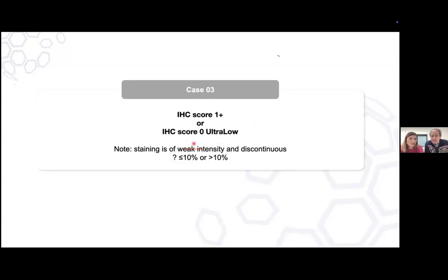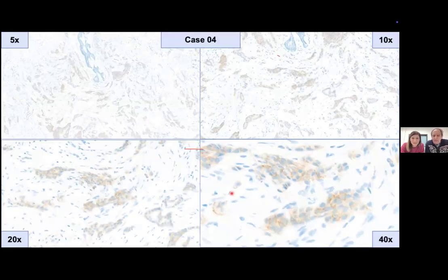Yes, fantastic. Apologize, somebody has written something we probably need to delete, but we'll remember it. That's fine. Next one. Okay, next case, number 4.